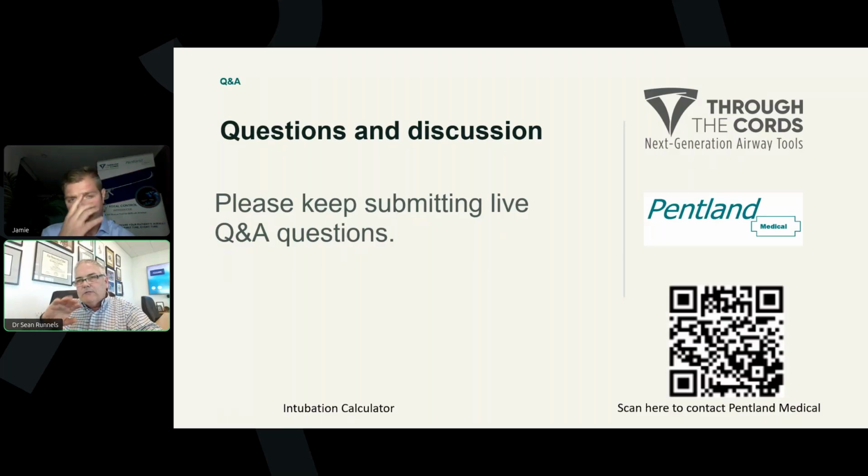We do have evidence that it's unpublished, but when you give providers a qualitative signal, that green, and you say, hold the catheter at the cords, keep the green zone in on exchanges, you get very little tip excursion below the vocal cords. When you ask them to look at numbers, you get a lot of tip excursion.